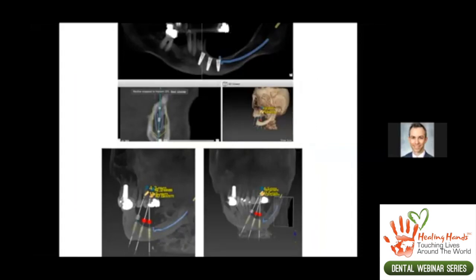Here's an example of a lady who had squamous cell carcinoma, and she had a marginal mandibulectomy. And you can see that she has a significant vertical bone height loss in the left mandible, and the nerve is quite high. We traced out the nerve after obtaining a CBCT scan, and we can also see that she's got some vertical bone loss around her mandibular incisor teeth. She wanted to keep some of her dentition on the right side, so we discussed a plan to place 3 implants that's going to support a bar and remove the remainder of the incisor teeth.